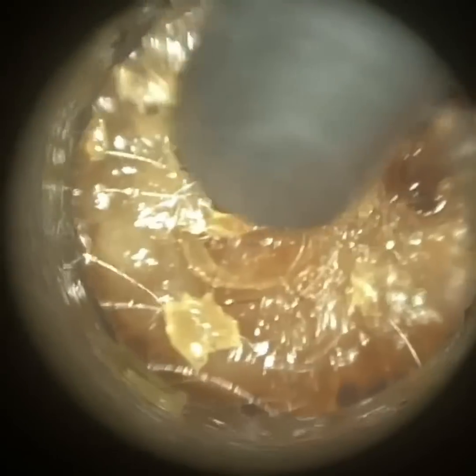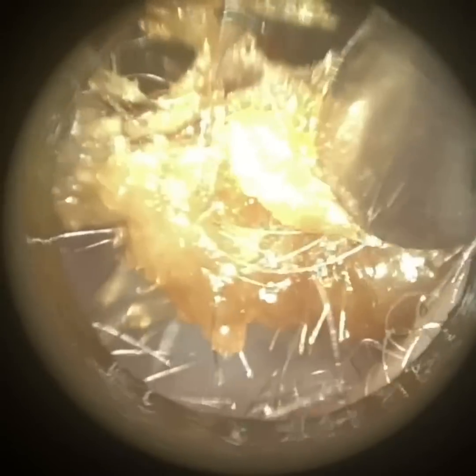In some people, the skin fails to migrate in the normal way. So instead of migrating sideways like a conveyor belt out of the ear, it migrates inwards to the center of the ear canal. And also, as the skin reaches the entrance of the ear canal, it doesn't separate into its individual skin cells, and it remains connected, and you get then a lamellar structure where you've got these long sheets of dead skin, and there's layers of these sheets of skin like an onion almost.